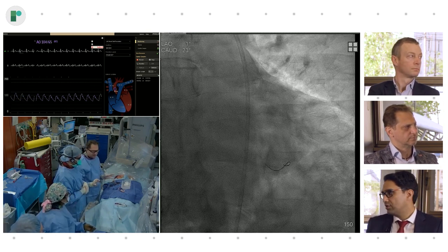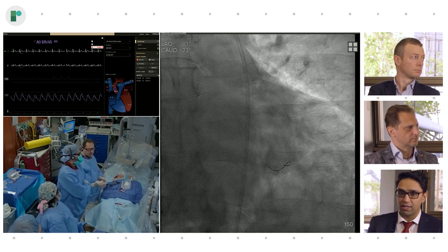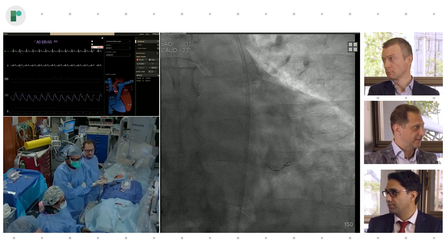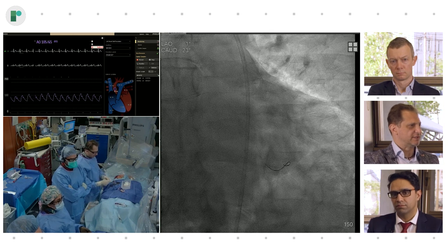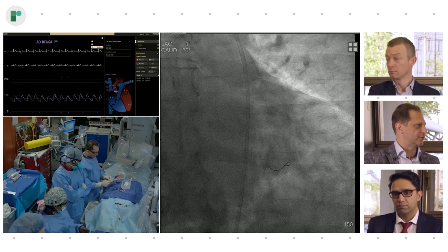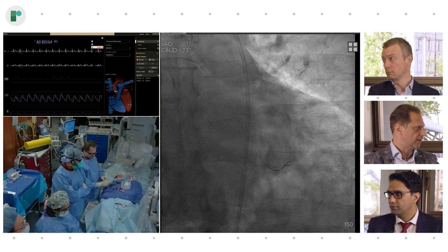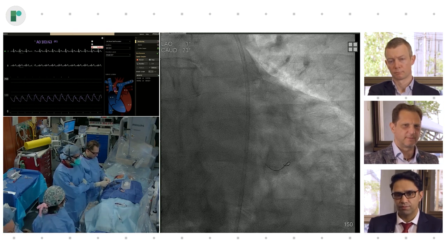And there's an advantage to be quantitative in these patients, especially when we're having a quantitative metric, like saying we need to be at an eGFR to contrast volume ratio. And you have the settings. So as opposed to just injecting what you think is right, you can preset, and you make sure you don't go over a certain volume with each injection, right? So I think it's very helpful for that purpose. And you have, of course, the flush feature if you want to just inject saline, for example, when you're looking for where the coronary is.